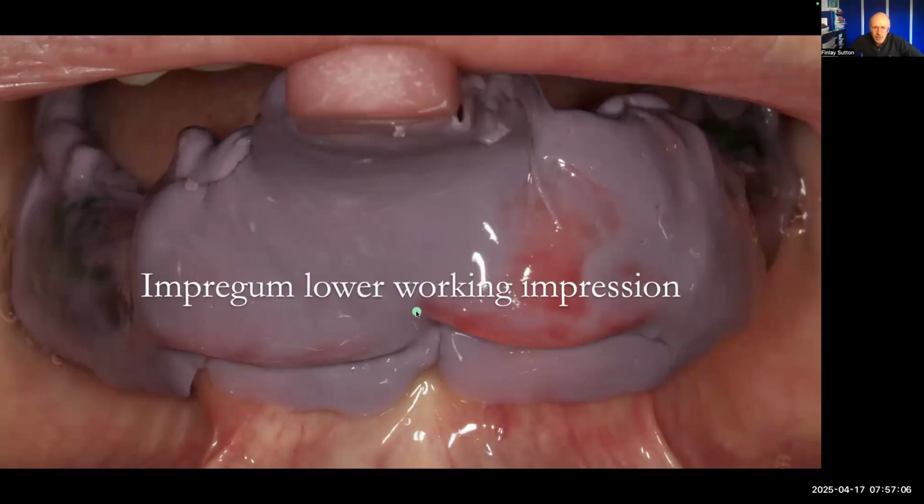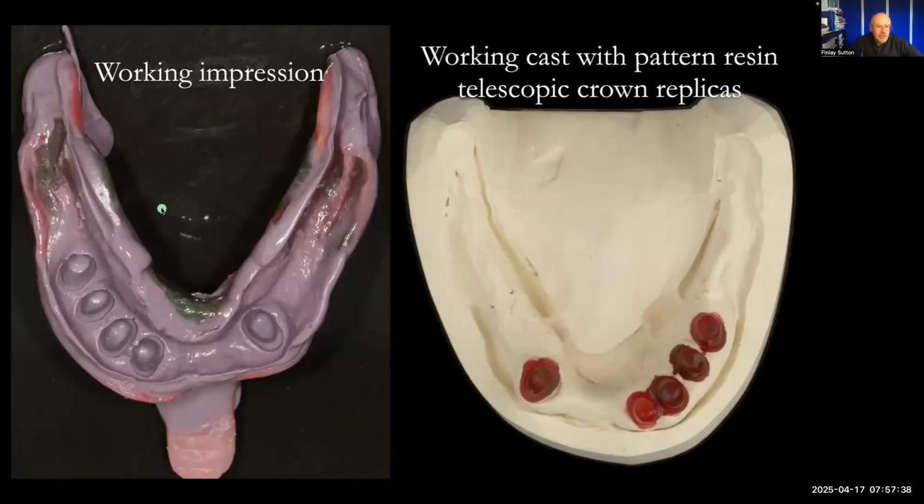So that's my lower working impression. Now, if you look here and you think, oh, this is all unsupported Impregum here at the front, it's just not important because the denture's not going to go down there at all, because we've got all those abutments and the denture's going to be finishing much higher up, very close to where the abutments are. But further back there and there, it's really important that's border moulded nicely. That's what I was thinking about anyway here. So nicely border moulded lingually with the tongue.